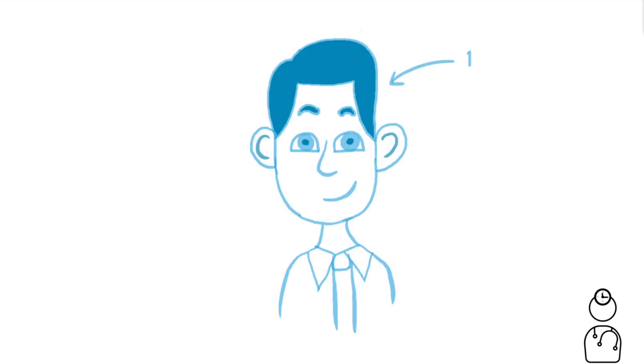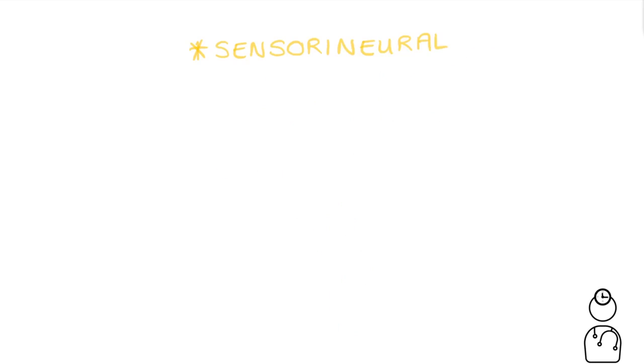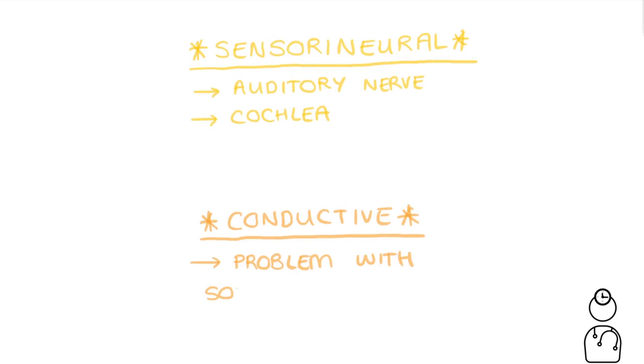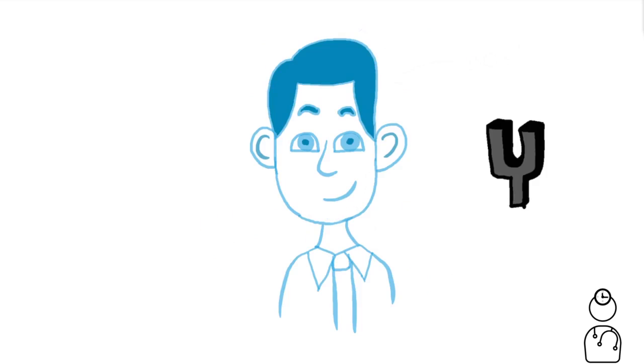This is Bob. Bob has a hearing problem, and it's up to us to figure out what's going on. There are two important hearing losses to consider: sensory neural, which means there's something wrong with the auditory nerve or the cochlea, and conductive hearing loss, when there's a problem with sound passing to the inner ear. We can use two tuning fork tests called Weber's and Rinne's tests in order to figure out what's going on.